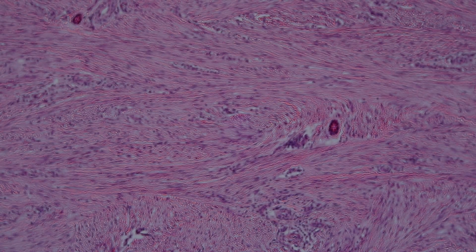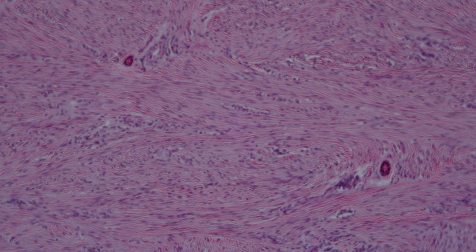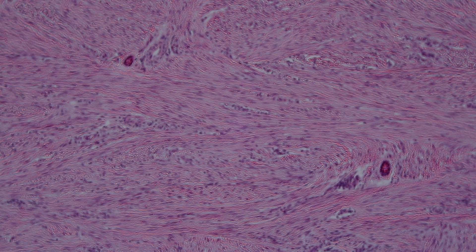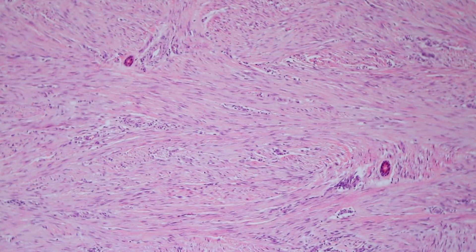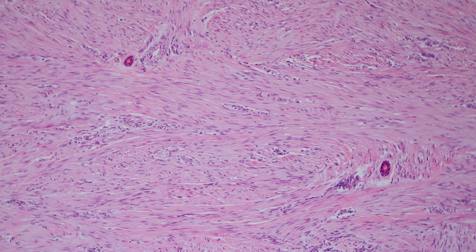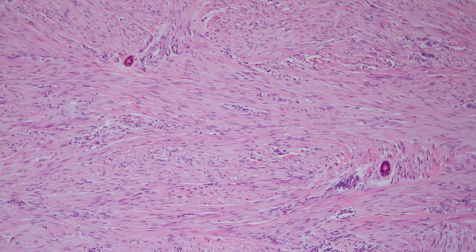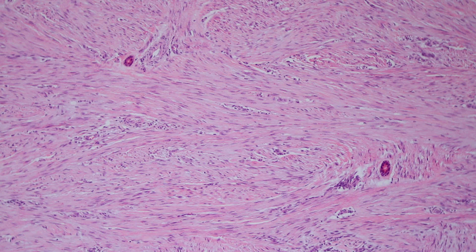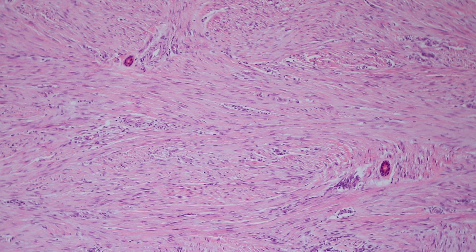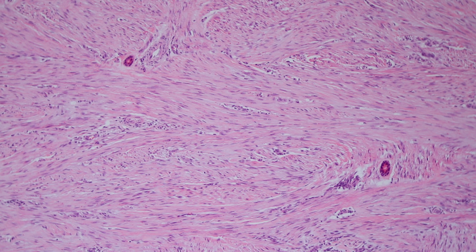You can see that these are fascicles here. I've got my condenser flipped so it gives this refractile look — I think it's a nice way to see the architecture of the cells. You can see they're streaming along in these fascicles, nowhere near as broad and wide as you'd see in desmoid fibromatosis. Desmoid fibromatosis rarely occurs on the hands or feet, rarely in young kids, and almost never involves the dermis unless it's part of a larger mass pushing up. I have a video on desmoid fibromatosis — I'll pop a link up in the upper right-hand corner.